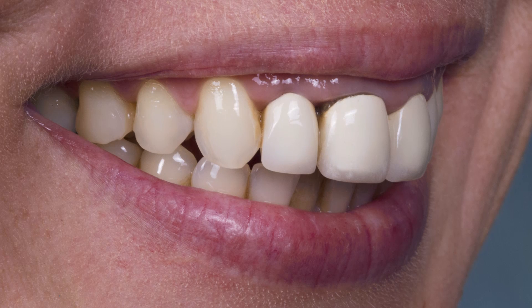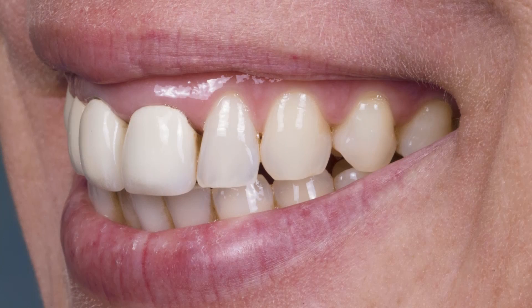Tooth number seven looks a little better, but you can see we've got some massive black triangles there. Those are going to be a little difficult to close because when you've lost papilla height like that, it gets very difficult to close them without creating a shelf of zirconia. This case was done by my associate, Dr. Mirasan, and it's a great example of how far we've come as a laboratory with Bruxer anterior.